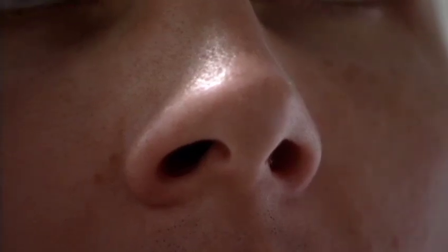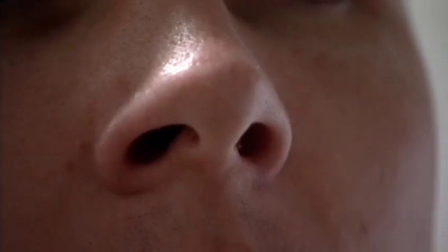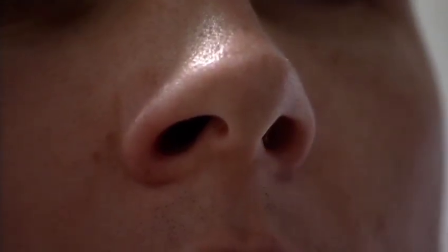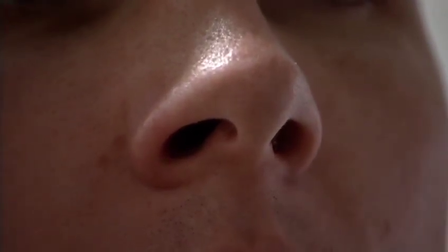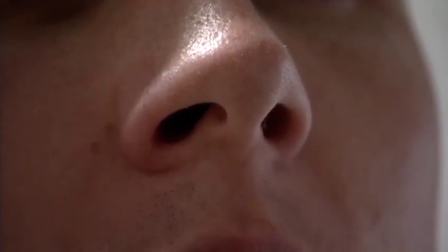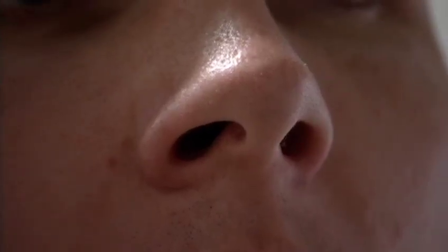Part of the examination of the nasal septum is to try and get an idea whether there's any extra tissue, thickening, hematoma in the nasal septum, or any perforation of the nasal septum. A good way to do that, in addition to just straight inspection, is transillumination of the septum. This involves shining light in one side of the nose, and I'll shine light in the left side of the nose in this case, and looking for the light being transmitted through the nasal septum. You should see a nice bright red glow.